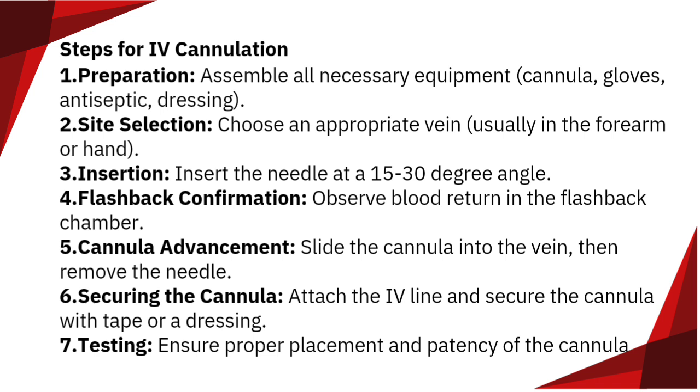Flashback confirmation. Observe blood return in the flashback chamber. Cannula advancement. Slide the cannula into the vein, then remove the needle. Securing the cannula. Attach the IV line and secure the cannula with tape or a dressing. Testing. Ensure proper placement and patency of the cannula.